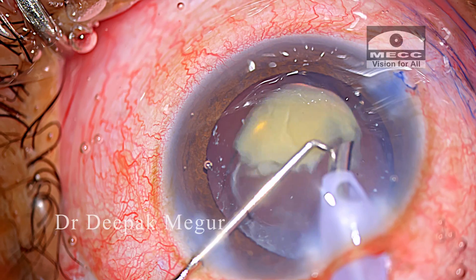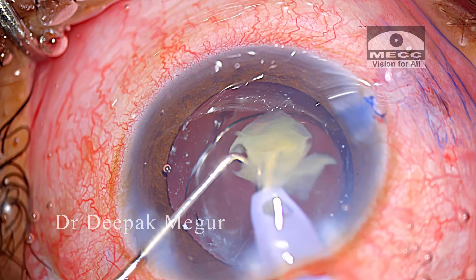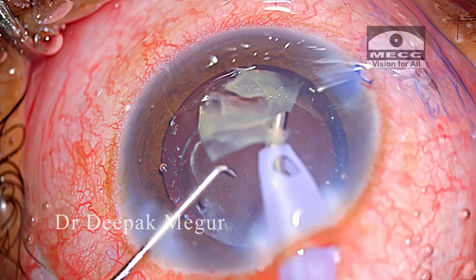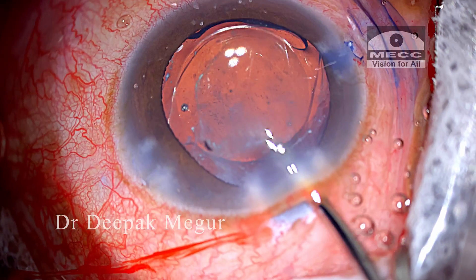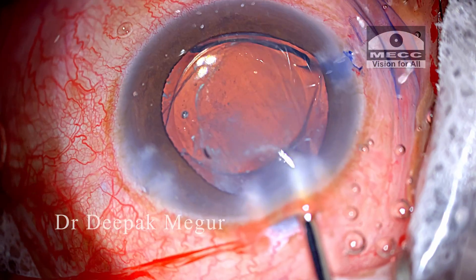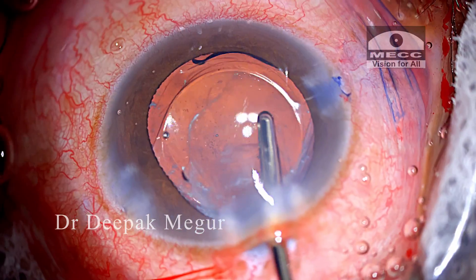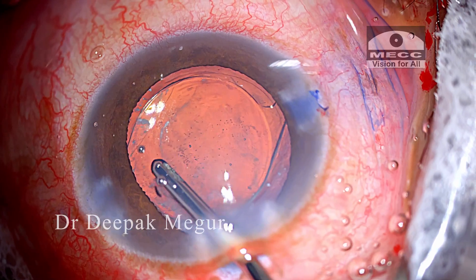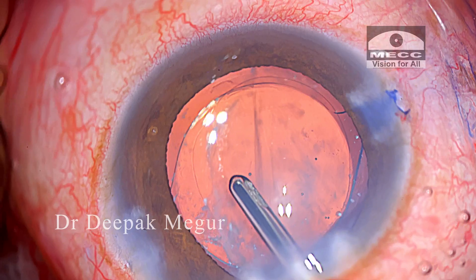The second hemi-nucleus is then divided and emulsified.